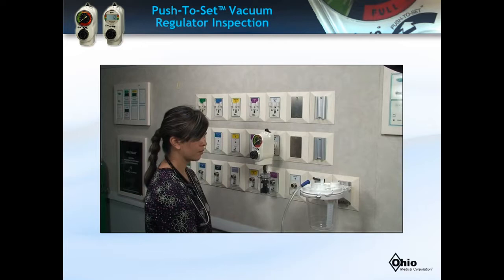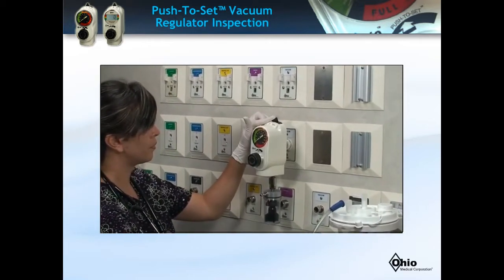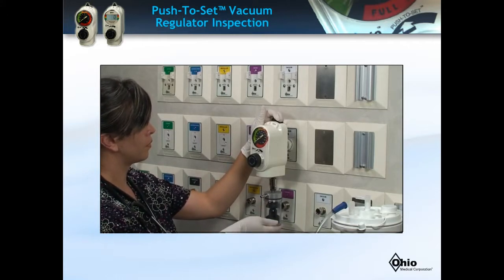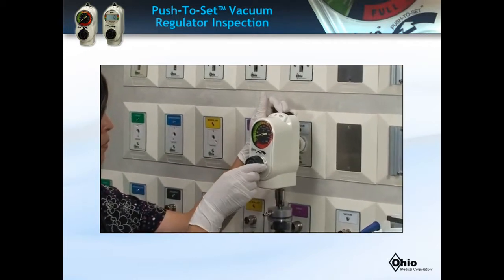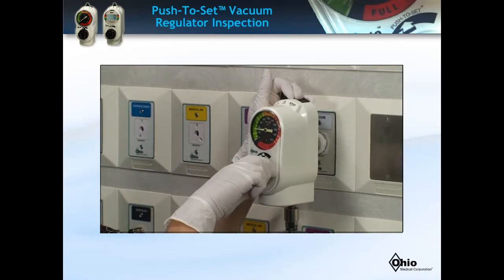In contrast, a properly working unit while in the off position will have the gauge read zero, and when turned on, during pressure adjustments the analog gauge should move freely forward and backwards. If your facility has purchased a digital push-to-set gauge, it should read zero in the off position, and values should increase and decrease freely in the on position while adjusting pressure.